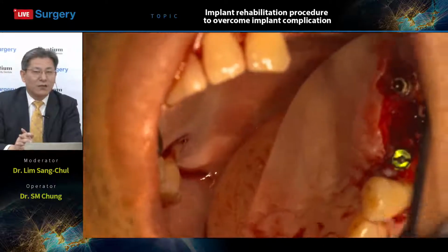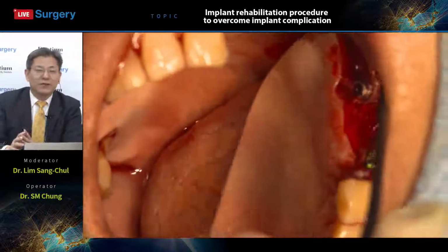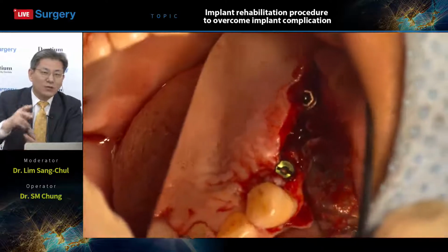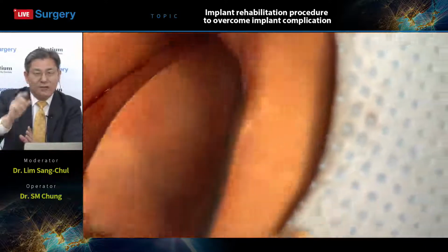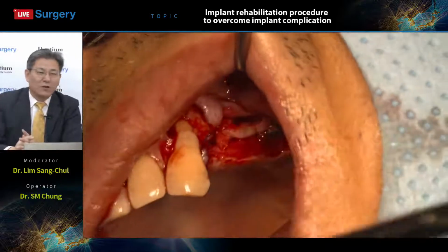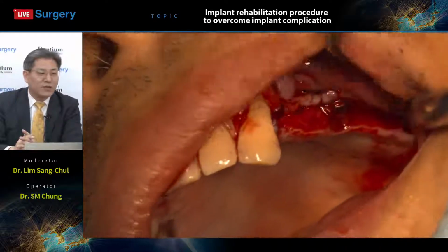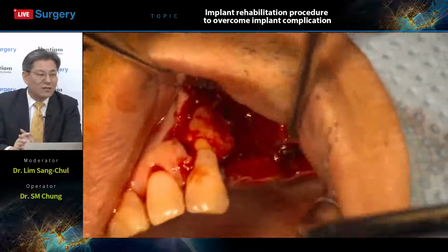I mean, when we have a steep area or a sloped bone area for implant installation, instead of a cover screw, when we use a healing abutment with smaller diameter and slightly higher length, it helps the implant fixation because of contact with the sloped bone. Right? So sometimes I prefer to use healing abutment instead of a cover screw, even though the insertion torque is a little bit lower.